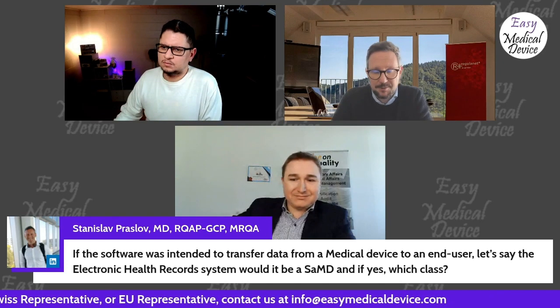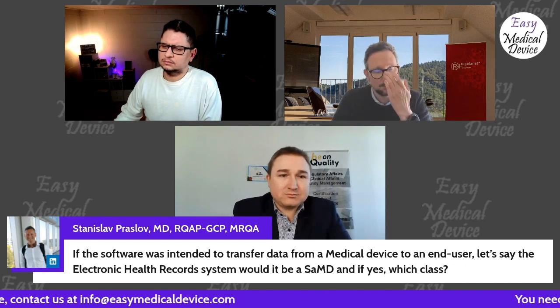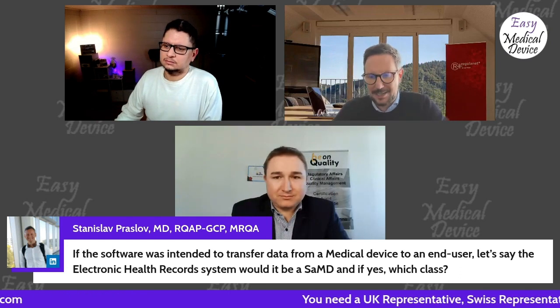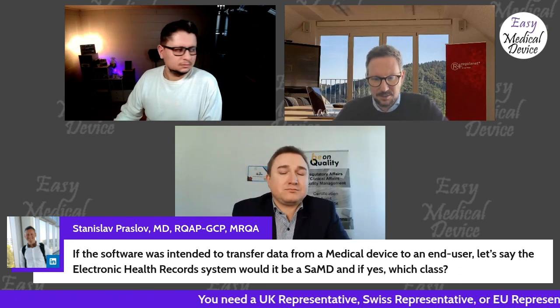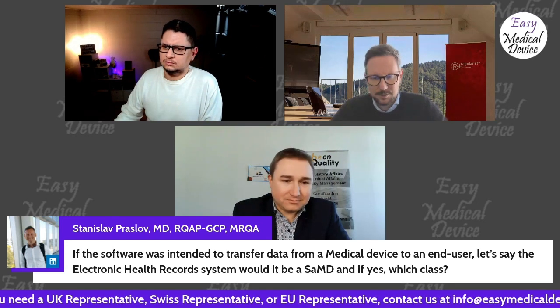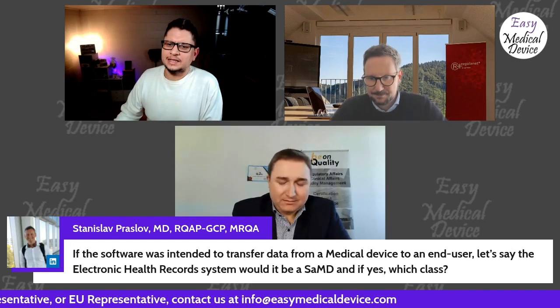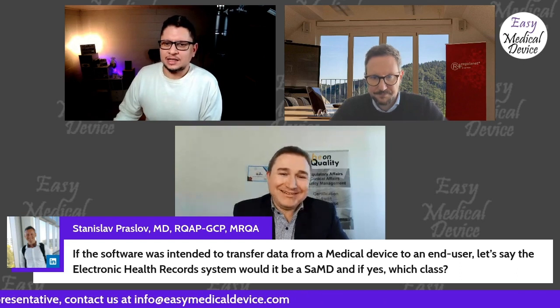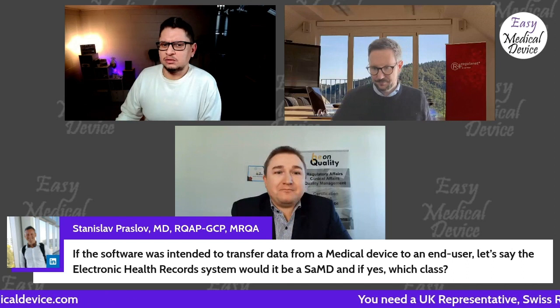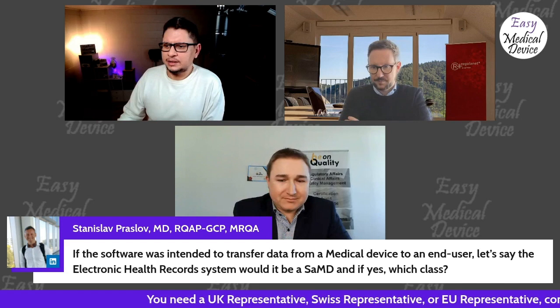Or if you already have done something up front with the data and then you transfer it. So you have a backend algorithm doing something with the data and then sending it somewhere into another database or towards an API to a clinical information system. Then this software will very likely be a medical device, but purely transferring data, no. It's like email, Outlook, if I can say. It's like saying Outlook is a medical device because it's just transferring data. As long as there is no transformation, modification, prognosis, decision, etc., then it's not really a device.